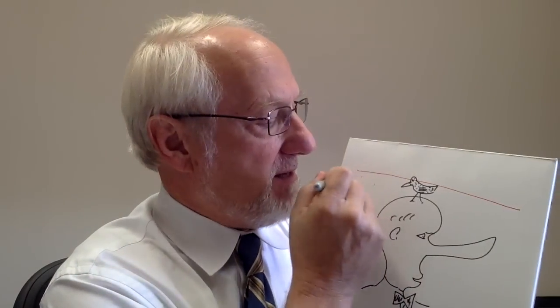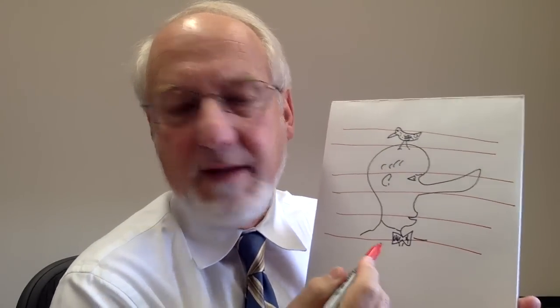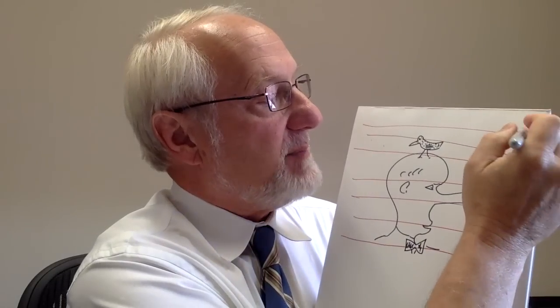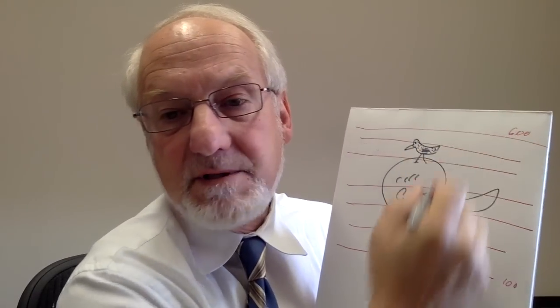So how do they turn that then into a picture? Well, that depends on an old parlor trick in mathematics. So if we take a picture like this in 2 dimensions, and we decide to draw something through the picture, like a line, then that line passes through at various levels. Where it passes through something dark, like let's say the person's bow tie at the bottom, it might be a small number, maybe 100. Where it passes through something that is not there at all, like up here, the number might be, say, 600. So what you get is a series of numbers like that.